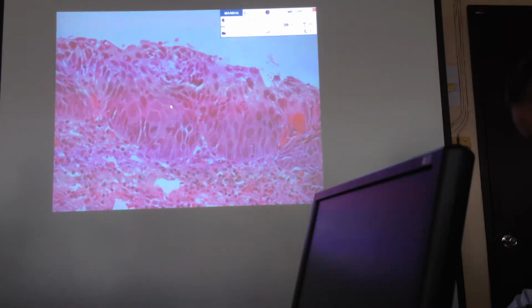So the difference between the severe dysplasia and CIN3, wherein it would already encompass the carcinoma in situ, would be based on the uppermost portion. If you see the presence of mature flattened cells in the uppermost portion, it would still fall under CIN3 in the current classification, but in the old classification, it would fall under the severe dysplasia.